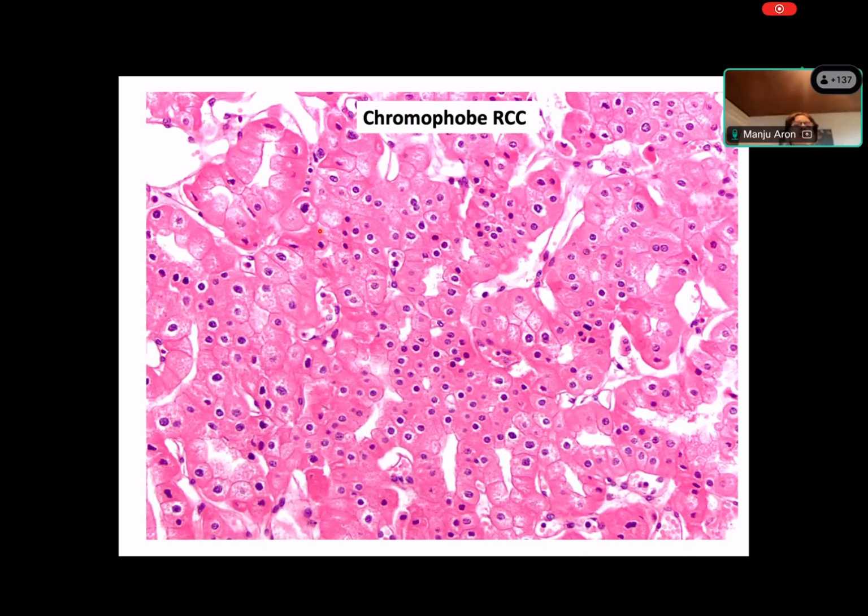But what you see is the perinuclear halos. The nuclear membrane irregularities still remain, and you can see the membrane prominence, right? So this is an example of chromophobe RCC.